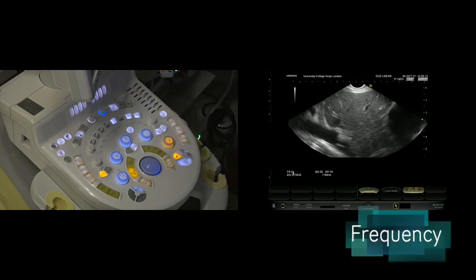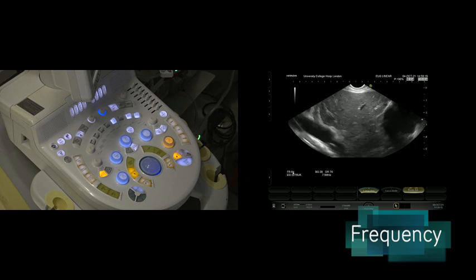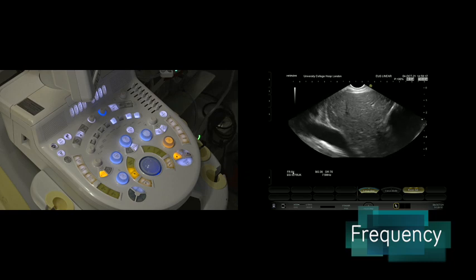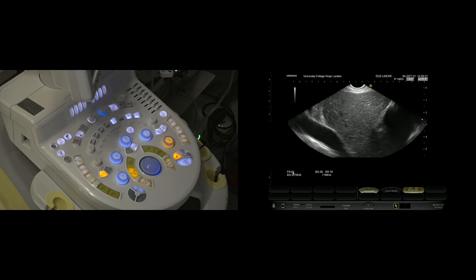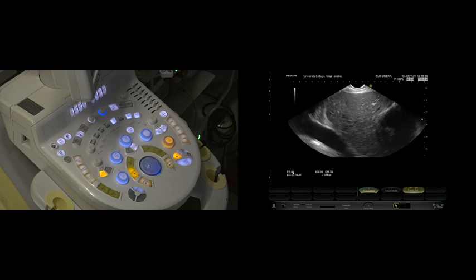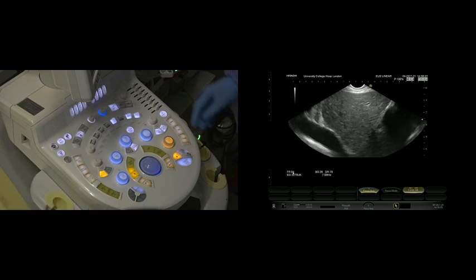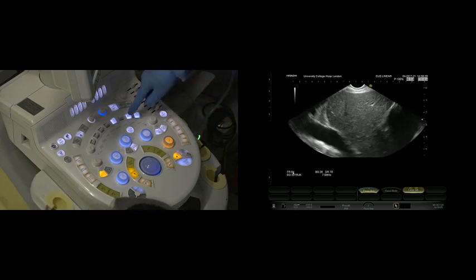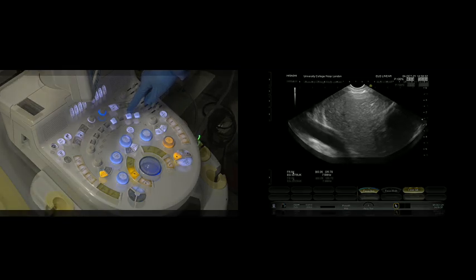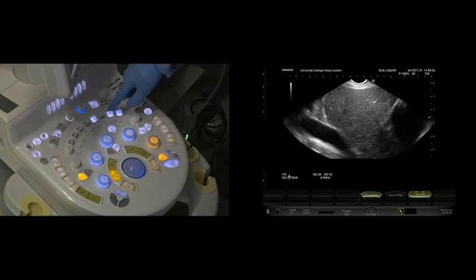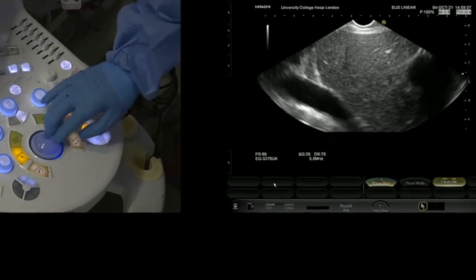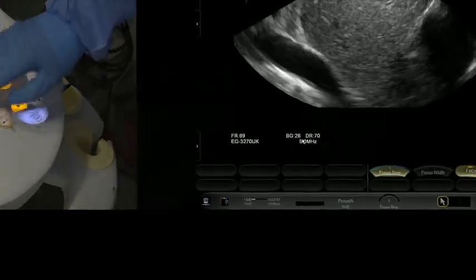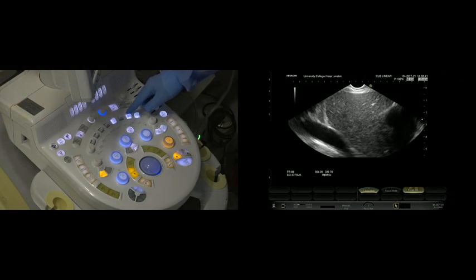The lower the sound's frequency, the further the sound wave will travel. Just think about a whale in the sea—the deeper the sound of the whale, the further the sound waves travel. The knob here on this particular device is the frequency. As I reduce the frequency down to five megahertz, that's telling me there what the frequency is. The sound waves are going to travel further and give me better images of deeper structures.